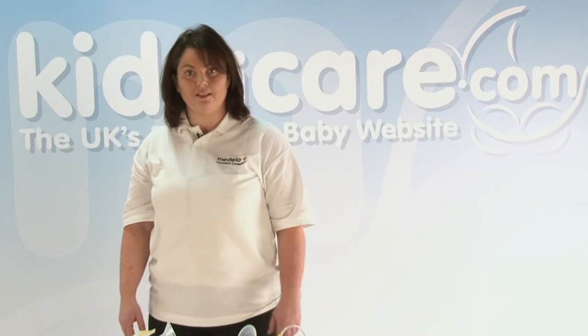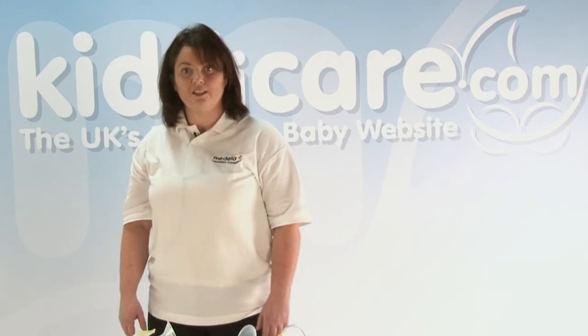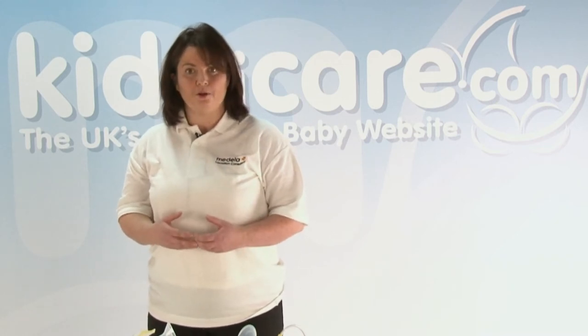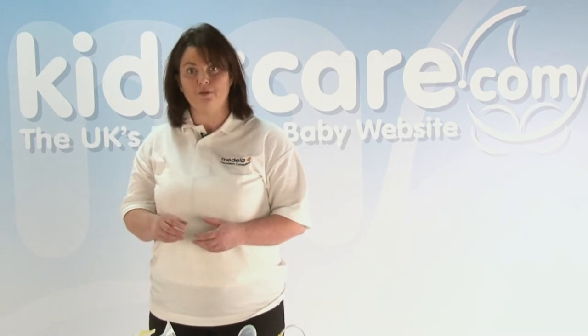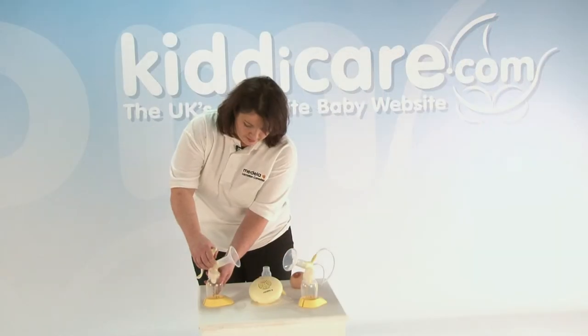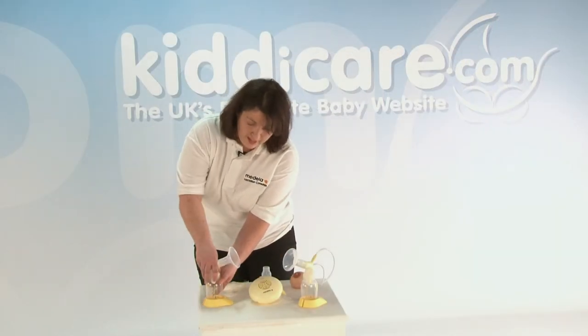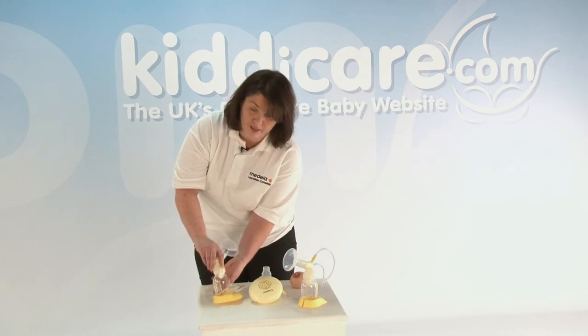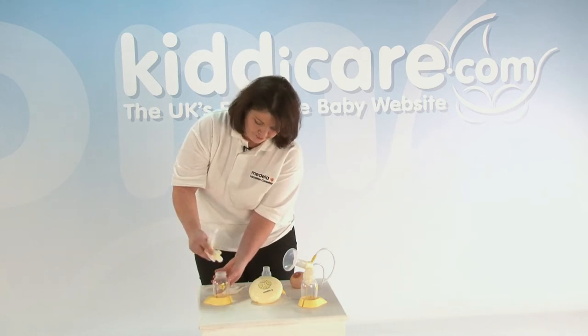Occasionally, your breast pump might not have been assembled properly. So go back to the basics. Take it all apart and make sure that you've fitted it in the right way. Check that you've actually cleaned it properly, because even a little bit of milk left over and not cleaned properly can affect the way that the membrane will work. The membrane is very, very important. Without this, your breast pump will not work.